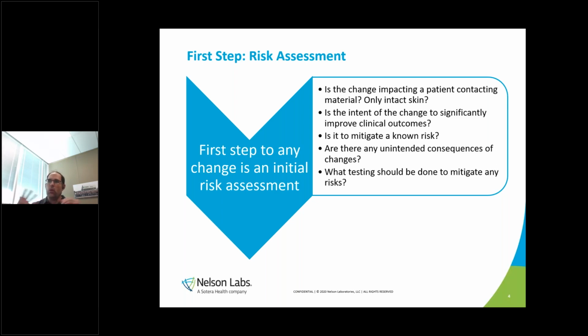So the question always comes up, well, if it's in the handle, that's sterilized together. There could be humidity present. There could be leachables that come through. And those are all concerns we want to evaluate. So I'm not saying that if it's in the handle that you're changing, that you're automatically clear. You still want to understand the materials that you're changing to, the likelihood of that leachability happening from your handle to your patient contacting portions. But those are things that go into the risk assessment.